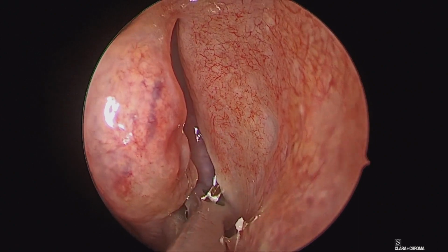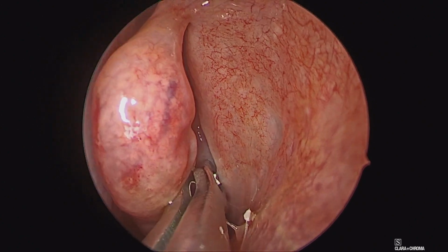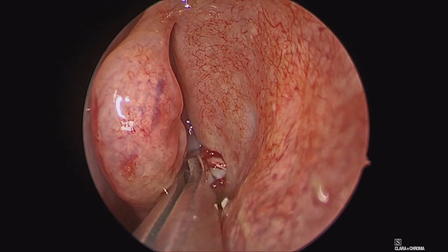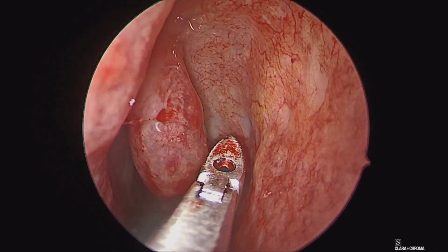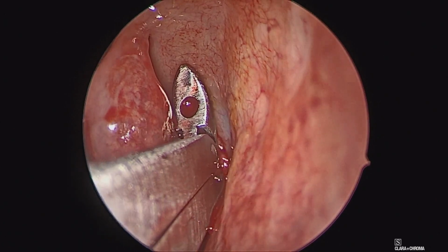Here we are completing the initial portion of a maxillary antrostomy. This is a pediatric Terrier backbiter performing a retrograde uncinectomy on the left side. And then we'll open and allow access to the maxillary sinus as we move posteriorly with our dissection.